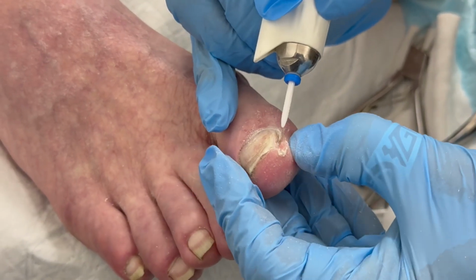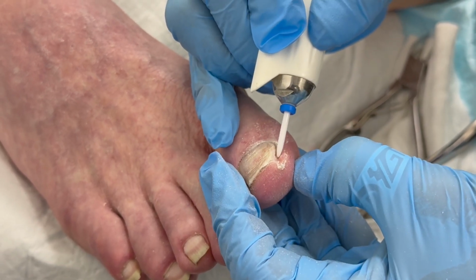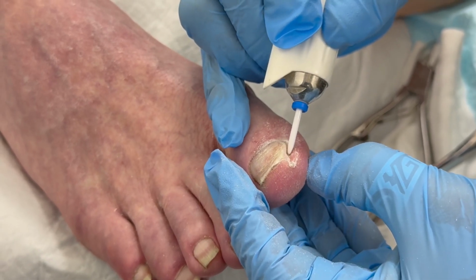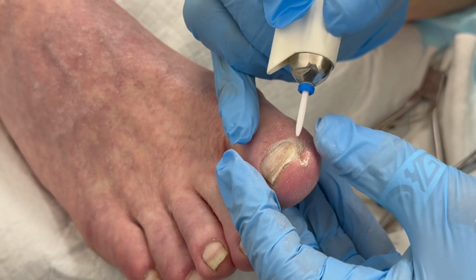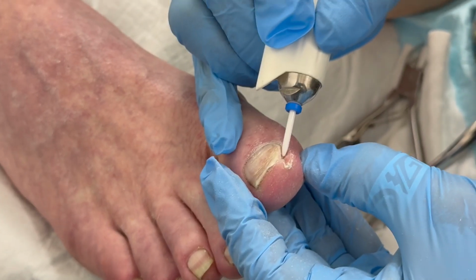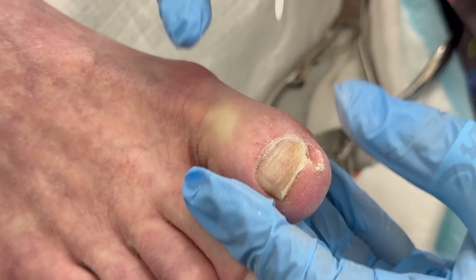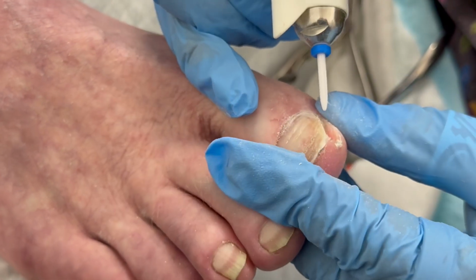So now what we're trying to do, the nail is ingrowing way down here, and that's where it's causing him pain, and I'm trying to disintegrate it, basically. This is where you just kind of tap very lightly, and if you do it enough, sometimes you can. It's like the Princess and the Pea, it's right on a nerve, and if we can get the nail disintegrated from on it. Now it might hurt just from me fooling around with it, but is this better so far? Yes, much better. Okay. We're doing good here.